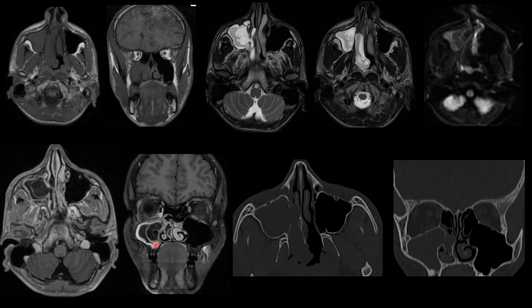On CT screening, there is erosion of the medial wall of the maxillary sinus and lateral wall of the nasal cavity, and erosions of the right inferior turbinate, middle turbinate, and uncinate process.